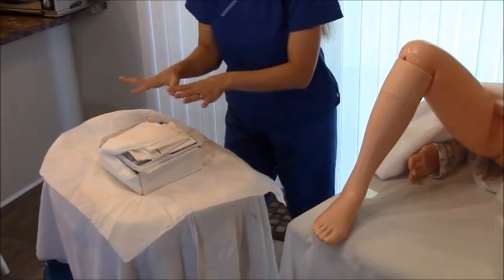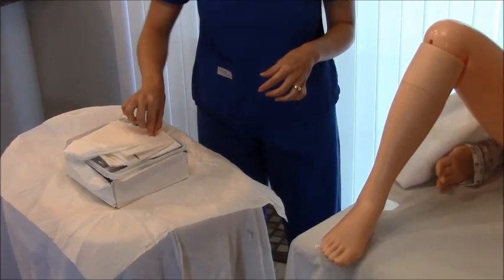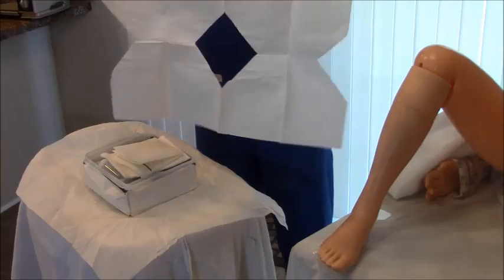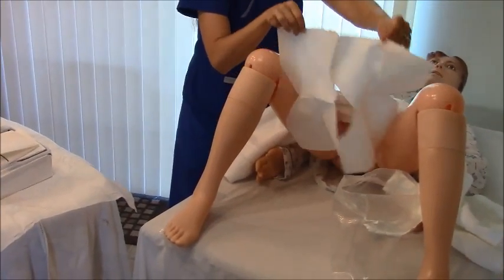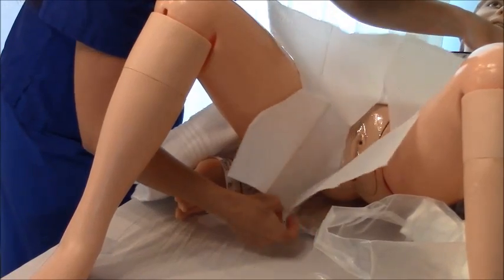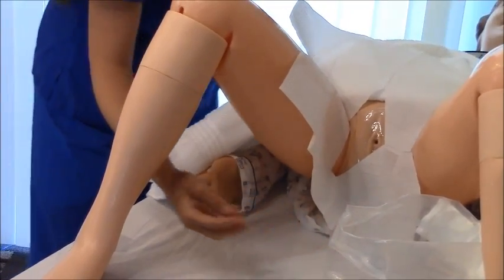Your kit is laid out in the order you'll use it. The first item is a drape. Remember you have two inches to grab without contaminating the field. Take the drape and place it around the vaginal area to protect the surrounding region. It can crinkle up a bit and may take some adjusting, but just lay it in place.